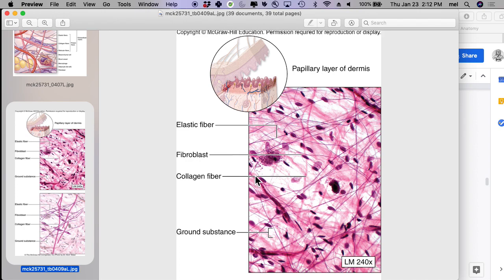But there's definitely some fibers in there, so fibroblast is kind of safe. If you can't remember what a cell is called in a connective tissue, guess fibroblast, right? Because, you know, it might be right. Could be, okay? So you can guess fibroblast cells. I learned them as, until you can tell, you just call them interstitial cells, which is cells that's in that fluid, interstitial fluid.